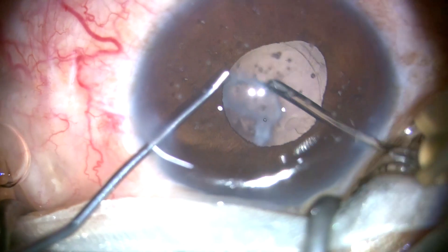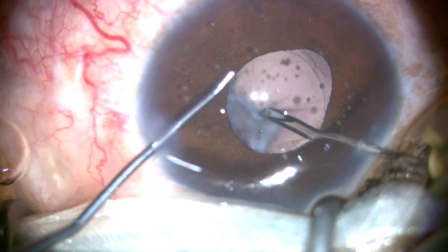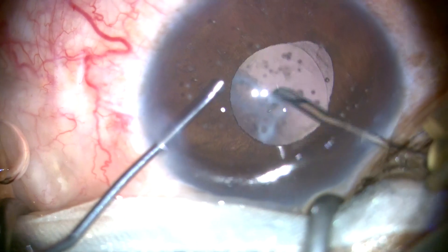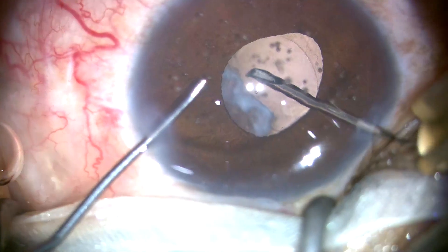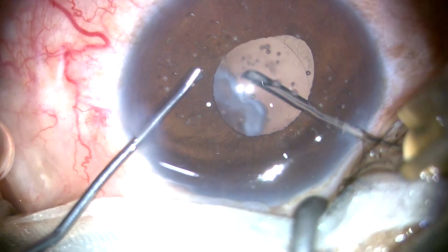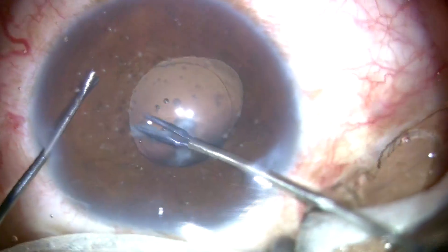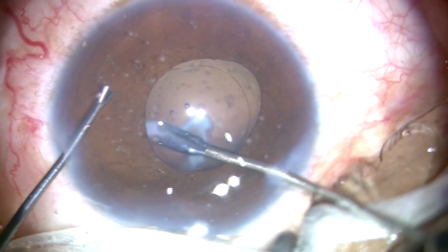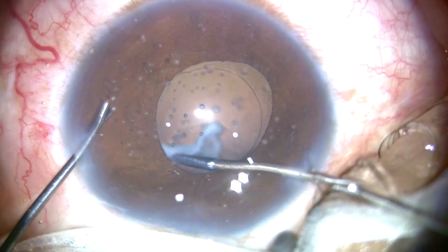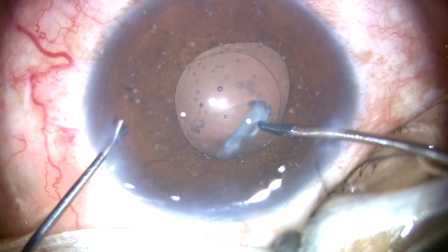My pressure should not be too much. Slowly, patiently. It came off the posterior capsule and the posterior capsule is intact — wow! And now I continue to tease off this plaque with the microforceps, and it is working fine.